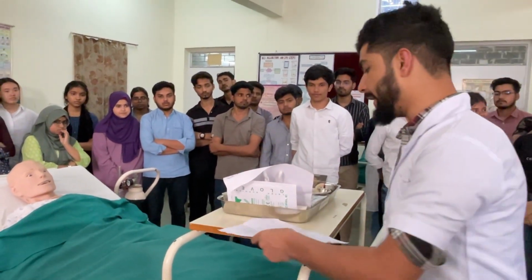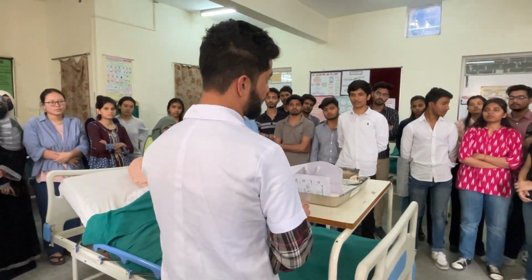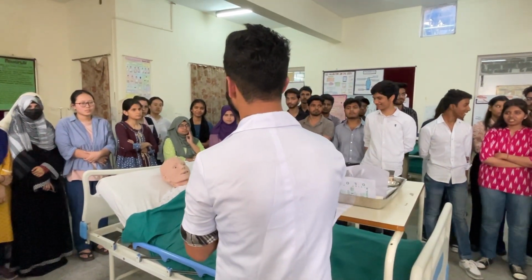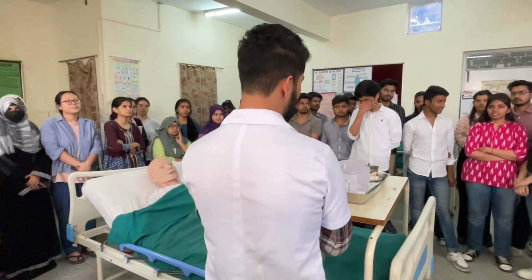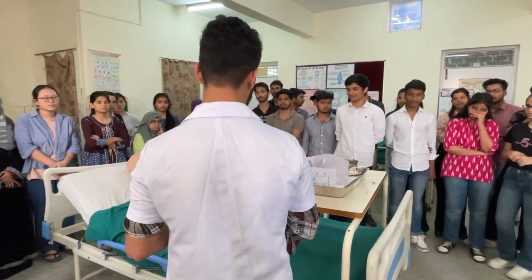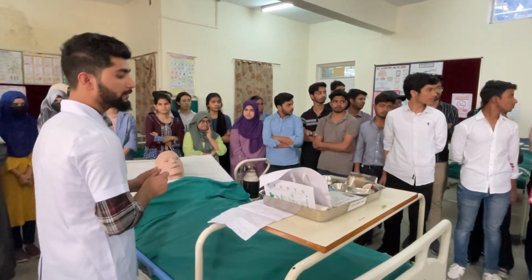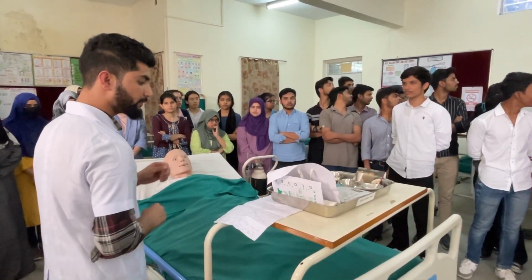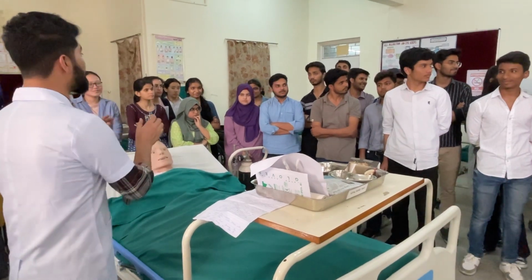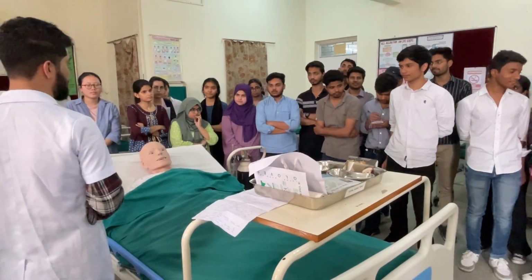So what do we have to do in the procedure? First, check the physician's order. Second point is take verbal consent from the patient. And the third point is assemble all articles required for the procedure.